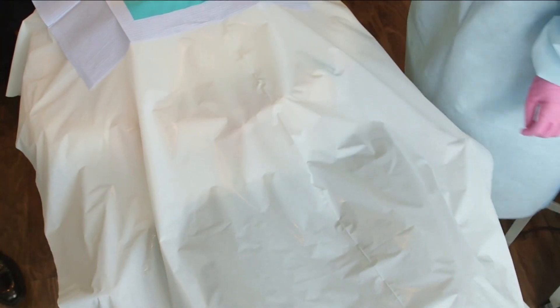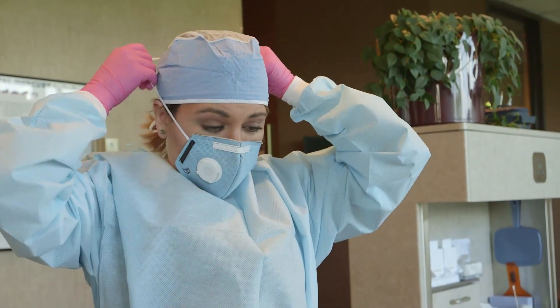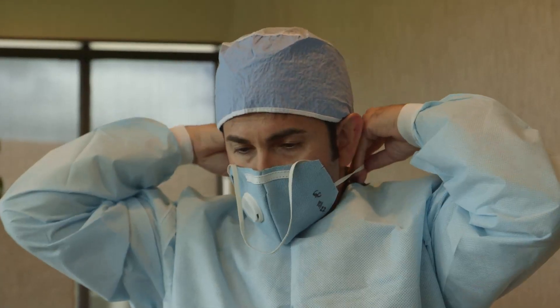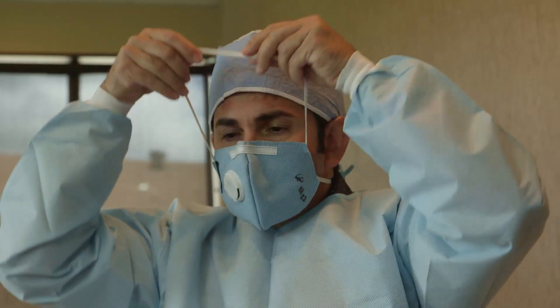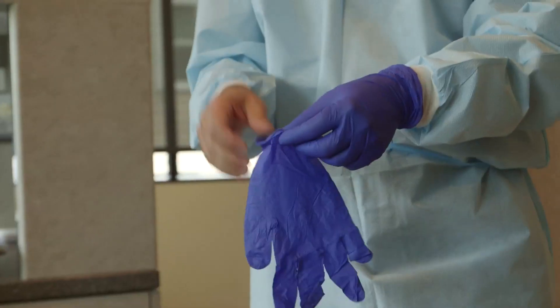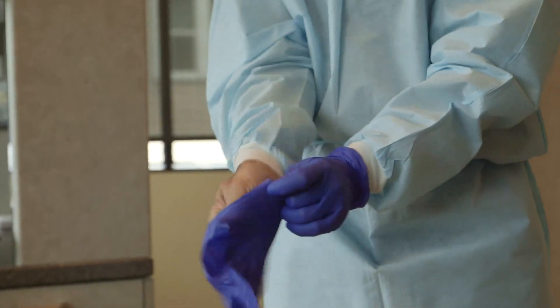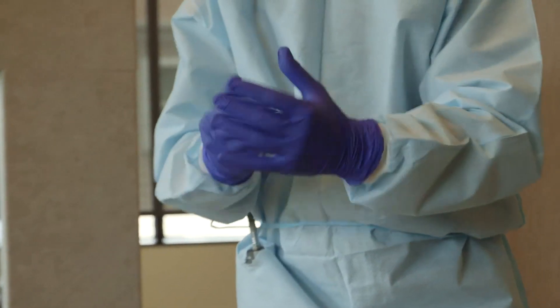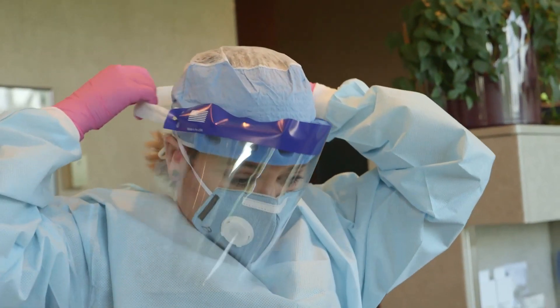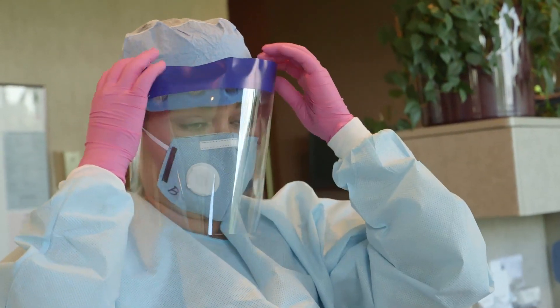Either a properly sealed respiratory grade mask rated to capture mercury, or a positive pressure properly sealed mask providing air or oxygen, should be worn by the dentist and all dental personnel in the room. Non-latex nitrile gloves should be utilized by the dentist and all dental personnel in the room. Face shields and hair or head coverings are also to be utilized by the dentist and all dental personnel in the room.